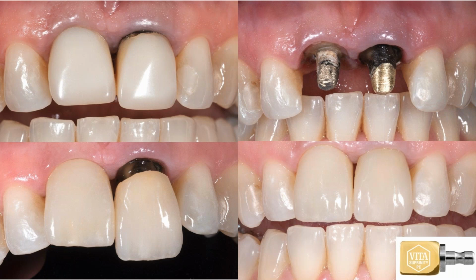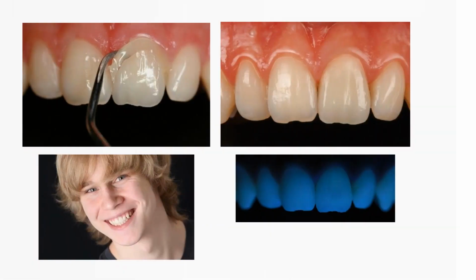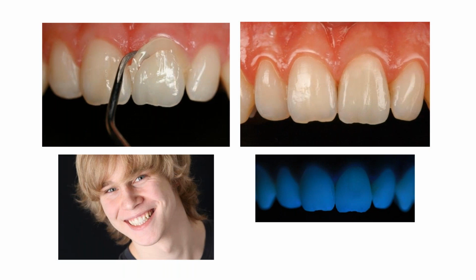It would be a far different case if you were doing a veneer versus a full crown, right? So you have to maybe select different materials for different objectives, different indications. With teeth that have a good background, you can get closer to the final shade of your material so that when you place it over the preps, it bleeds through with the right color, with the right shade. You're looking for those preps to come through to give you a little bit more color, more of a natural look. So the translucency just helps you blend in with those teeth. And then, of course, you need to discover if your patient goes out, whether they need a material that has a little bit more fluorescence or not.